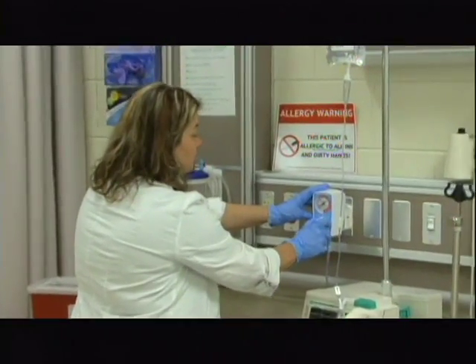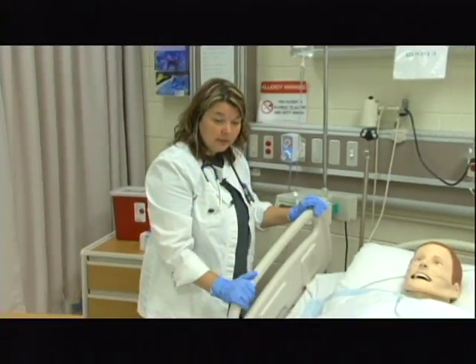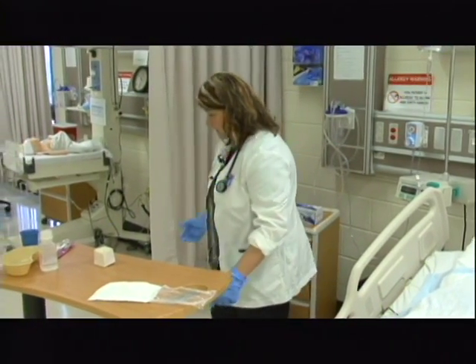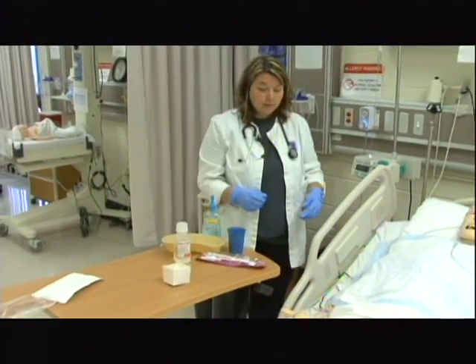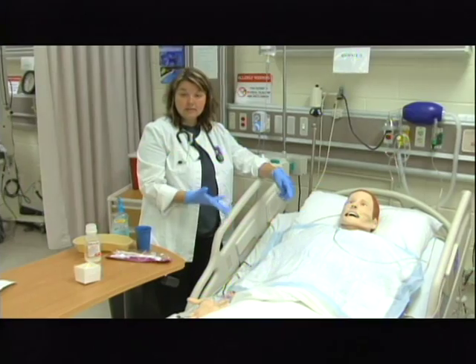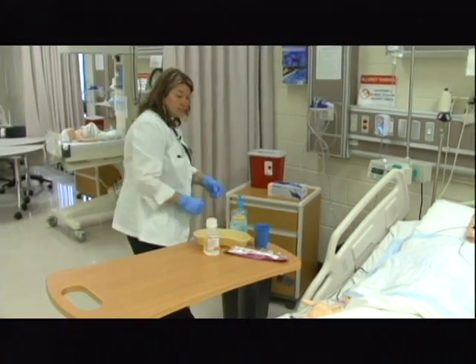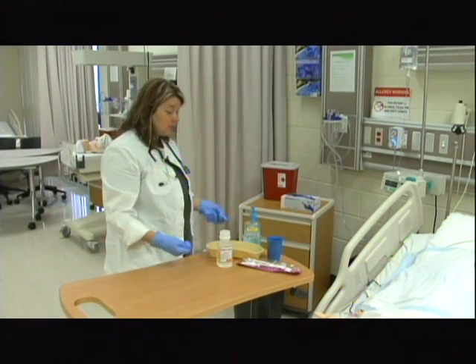I've established that the bed is low and locked. I'm going to make sure he has his call bell within reach and the trash can is within reach. I would return his table and make sure it's within reach. If he was ready for mouth care, I would provide that at this time. If he needed pain medication, I would address that — he says he's fine. I'm going to make sure the rest of the equipment is cleaned up, getting rid of the packaging and suction equipment as necessary. If the table needed to be cleaned and dried, I would do that at this point as well.